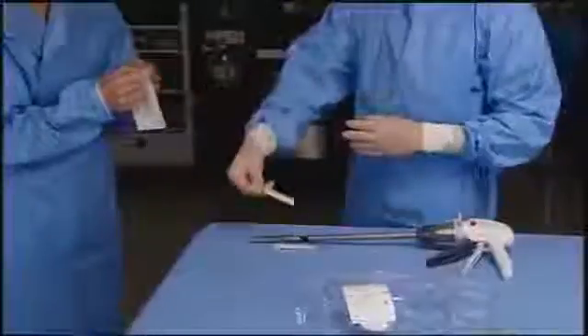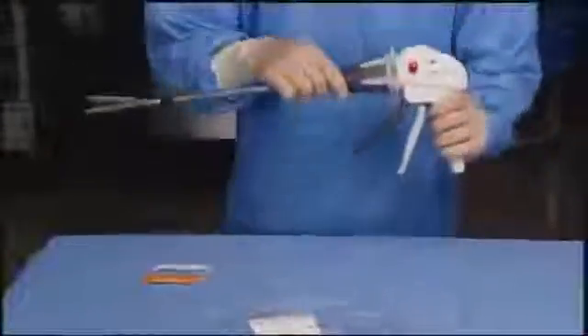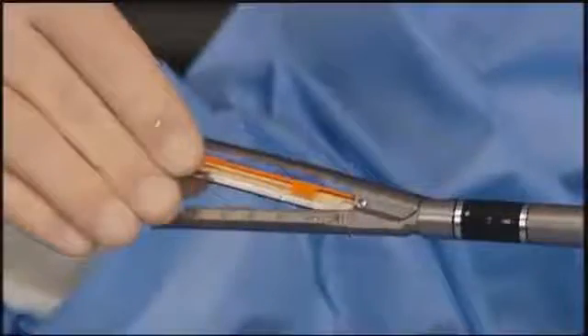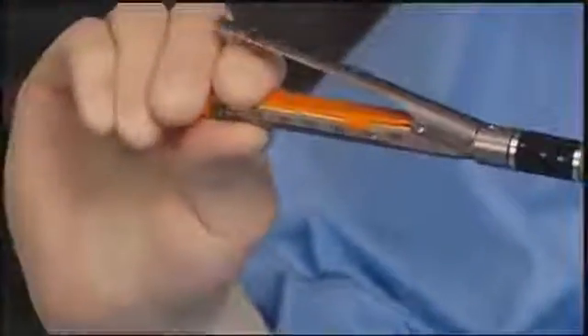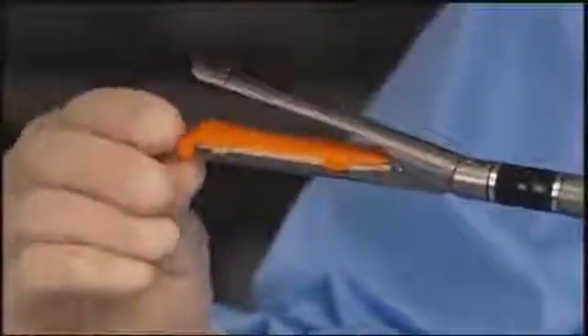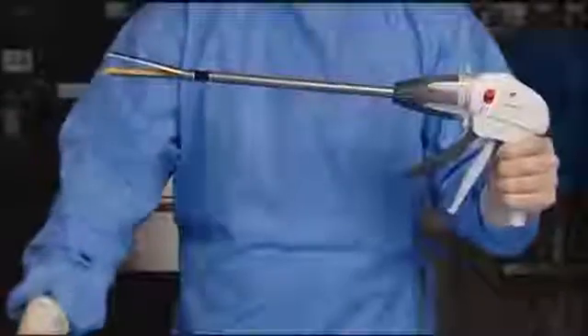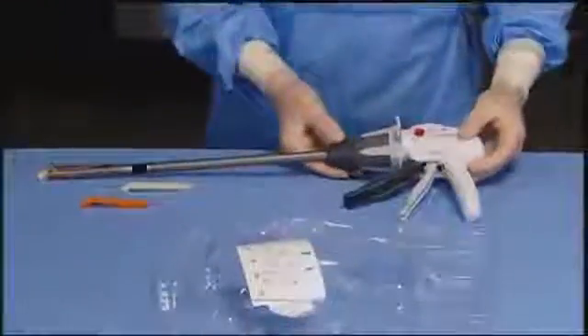Using sterile technique, remove the reload from the package. To avoid damage, do not flip the reload into the sterile field. Insert the new reload by sliding it against the bottom of the cartridge jaw until the cartridge alignment tab stops in the reload alignment slot. Snap the reload securely in place. Remove the staple retaining cap and discard. The instrument is now loaded and ready for use.